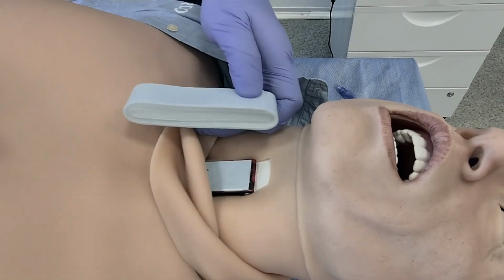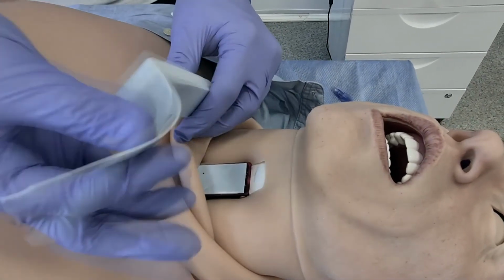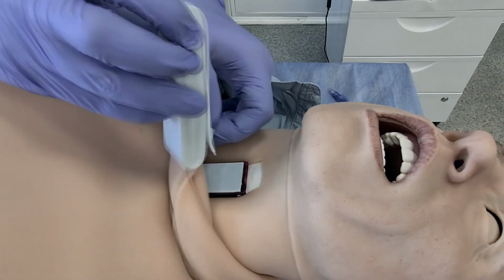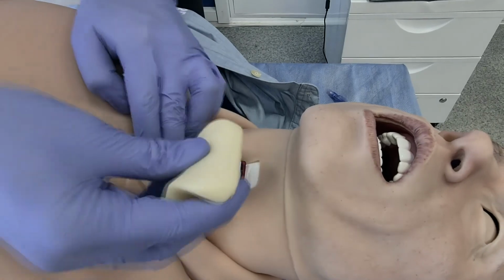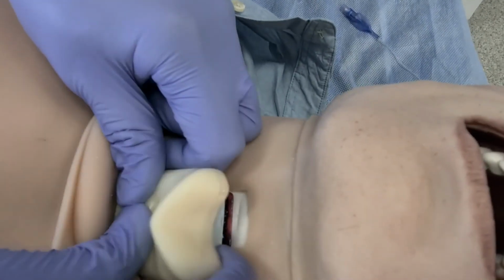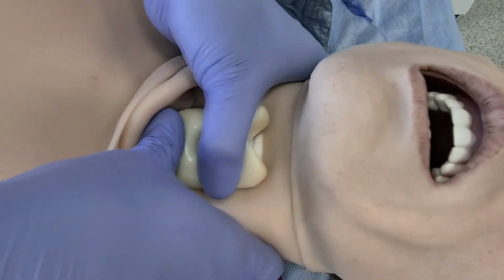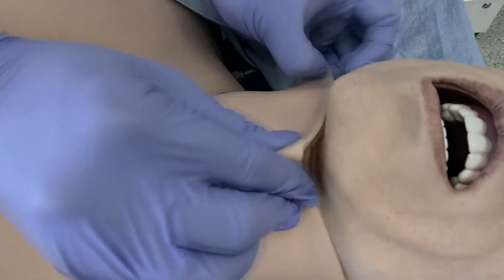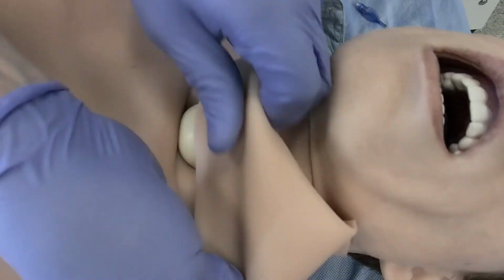After you roll up the neck skin, carefully remove the cricoid. More and less prominent ones are included. Apply the tape and cut to a fitting length for a proper seal. Put the cricoid back on, first sliding it in at the bottom, and then pressing on the top part until it clicks into place.